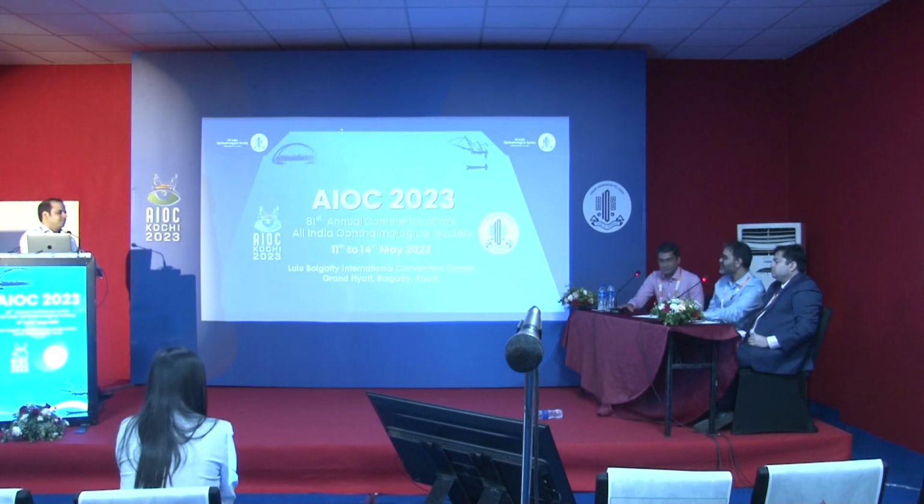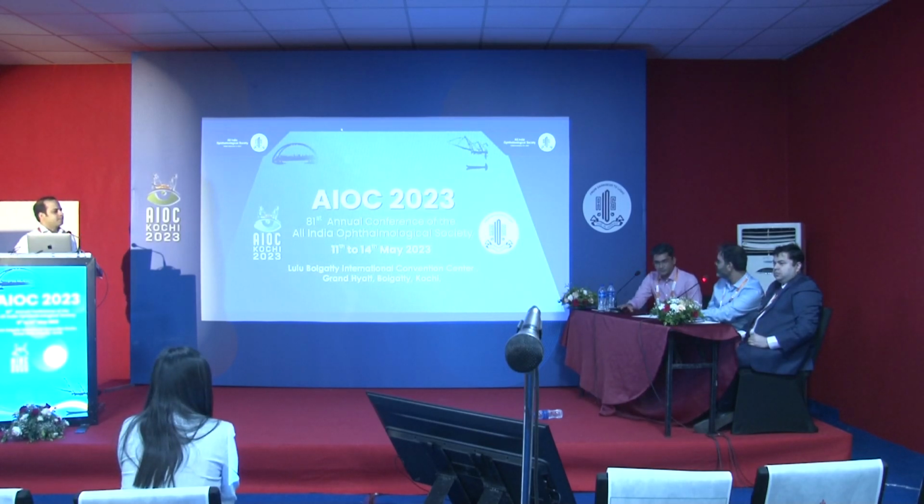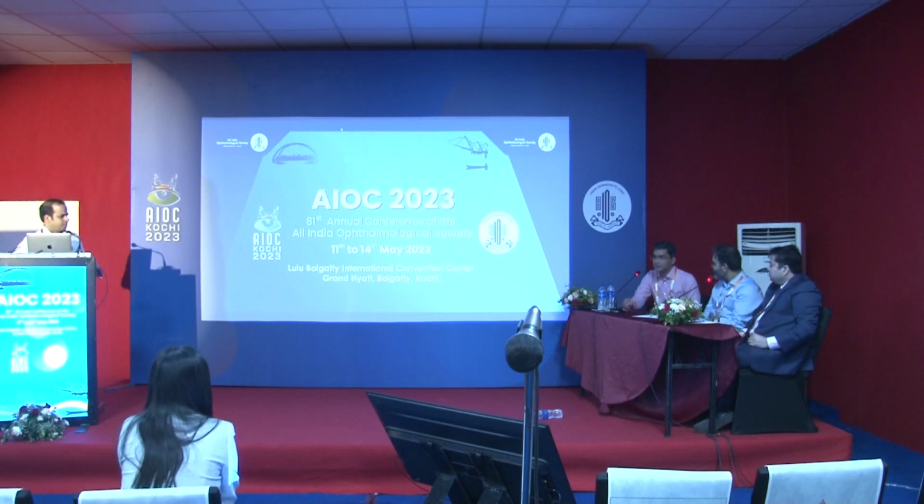And if we are taking the cyst out and it bursts, then it's difficult to manage that. So the way we went, the idea is that it should not burst. I have seen Dr. Mahesh operating such cases by going not so posterior, but near the equator and just posterior to it, and removing it transclerally, right? So not even doing a vitrectomy. We have seen him doing all that, but yes, we have seen him doing vitrectomy also.